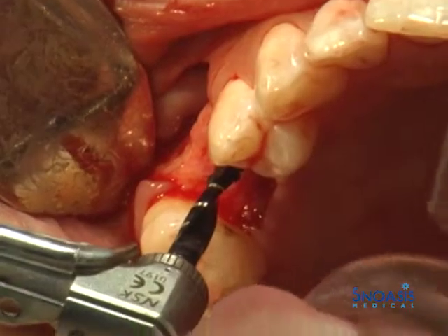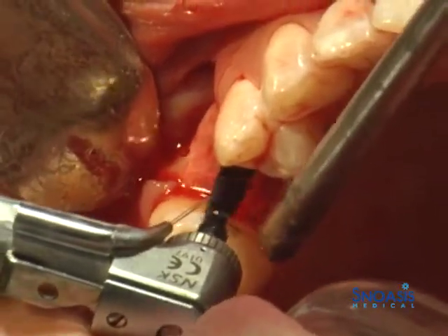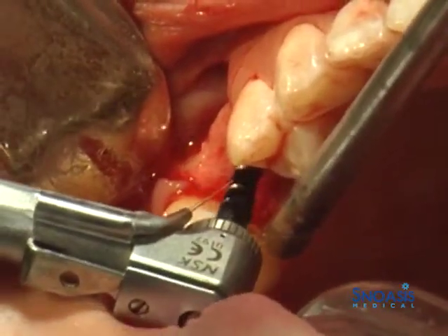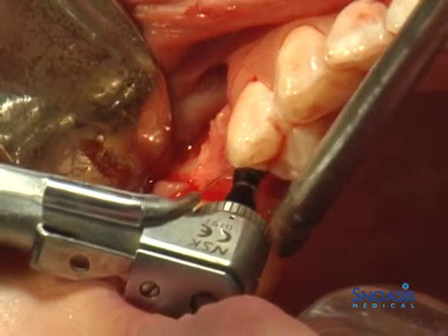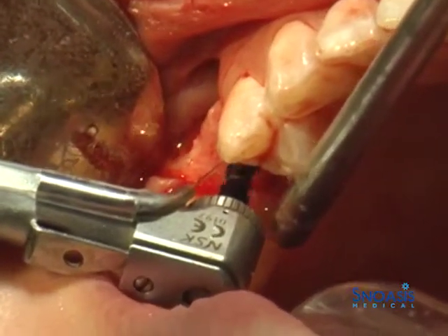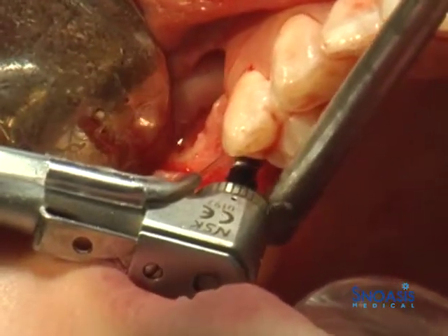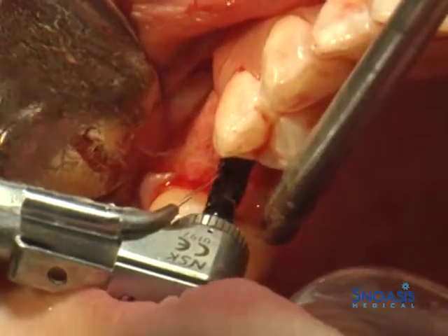A NOBEL active implant protocol is used for initial drilling of the implant osteotomy up to the diameter just prior to the final diameter drill for implant placement.